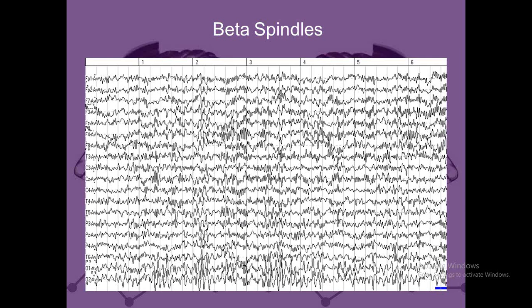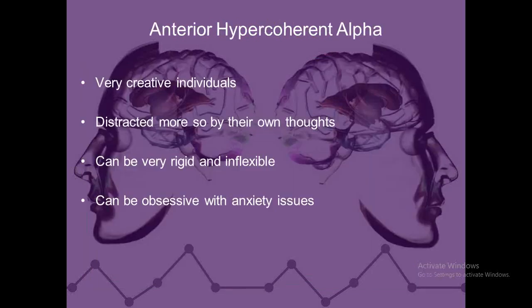Now this is where, if you don't look at the EEG, you can't see the morphology. You can see excessive beta in a lot slower range, and you can just mistake it as, oh, well, that's good, or that's just a little anxiety. But these beta spindles are specific and have a specific pattern, a specific intervention that will help out.